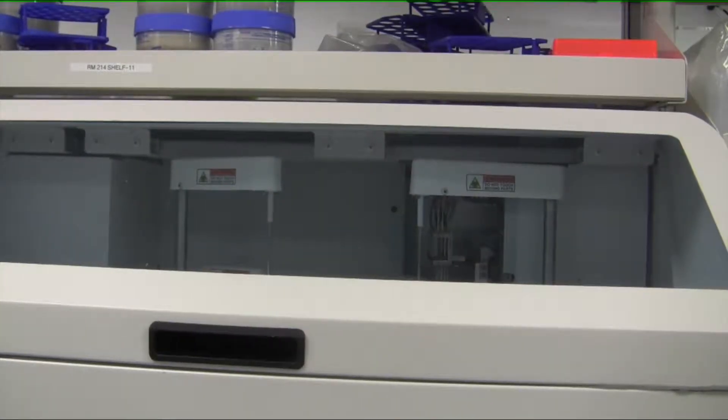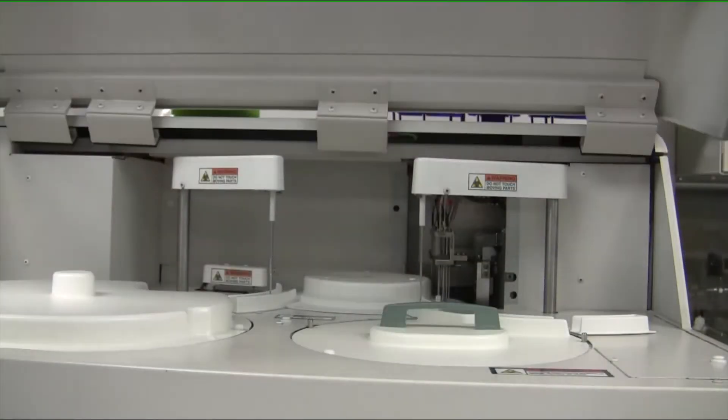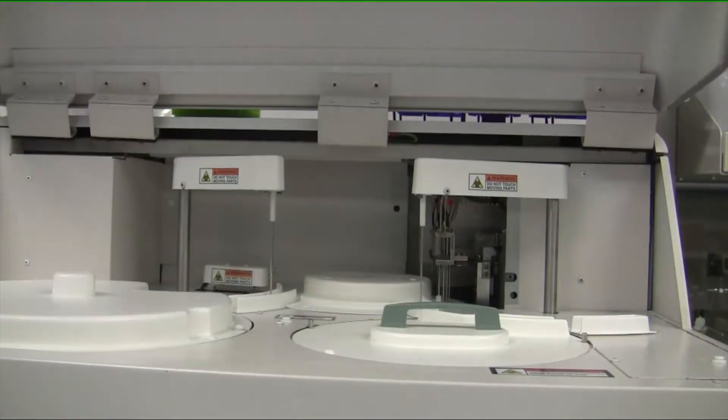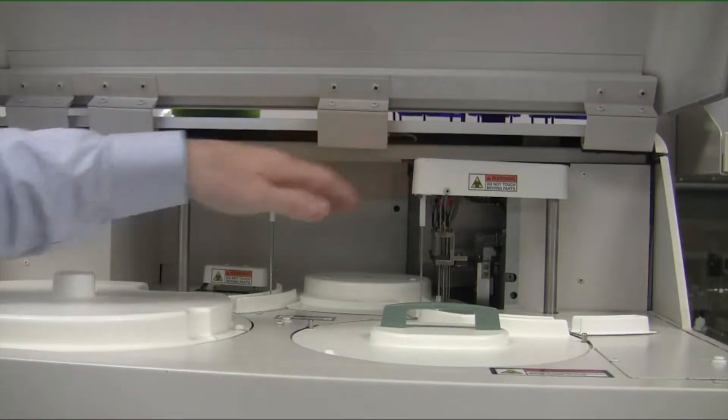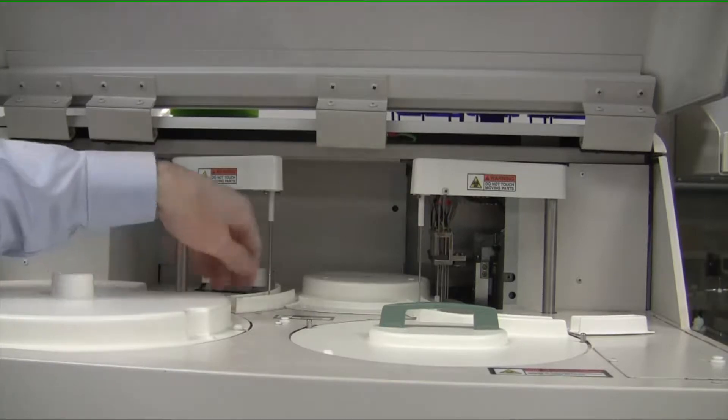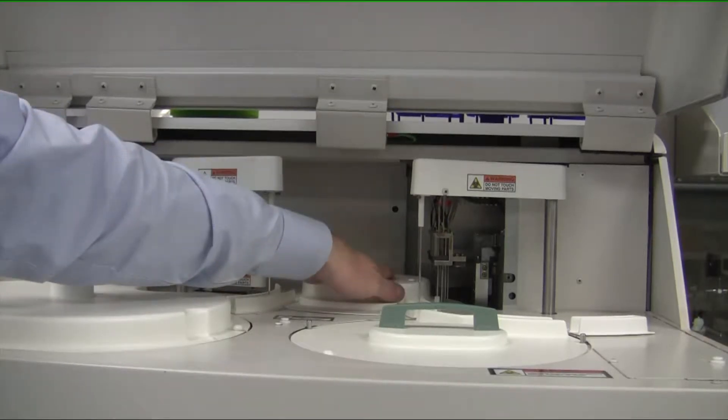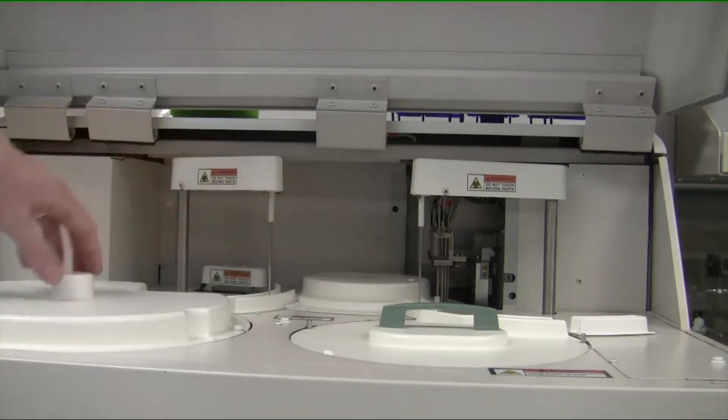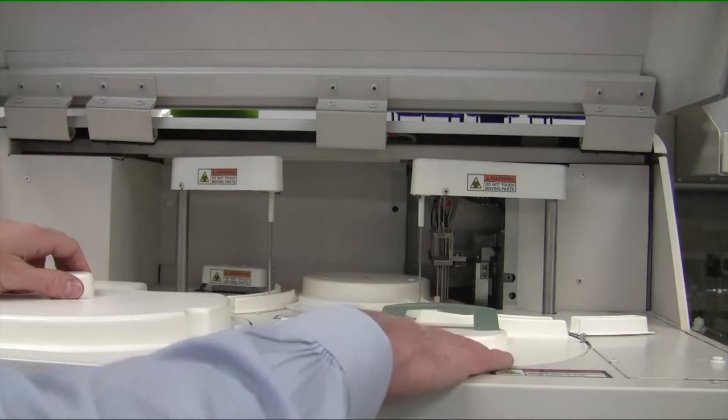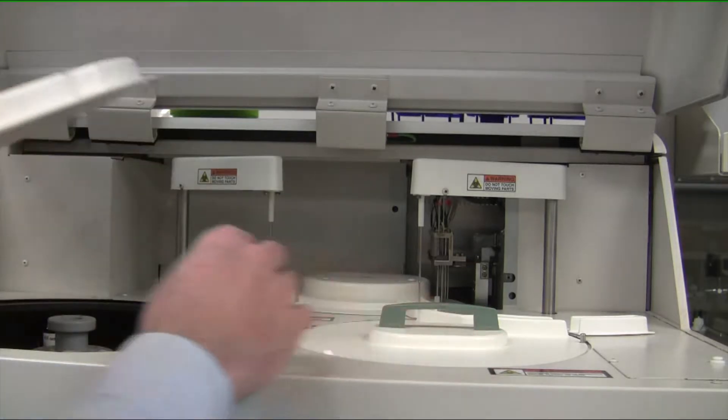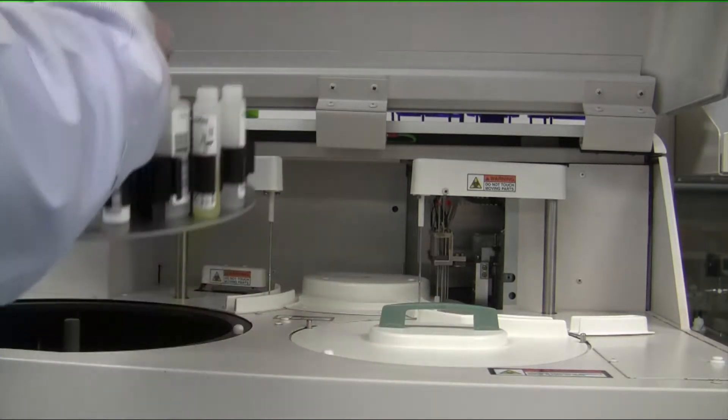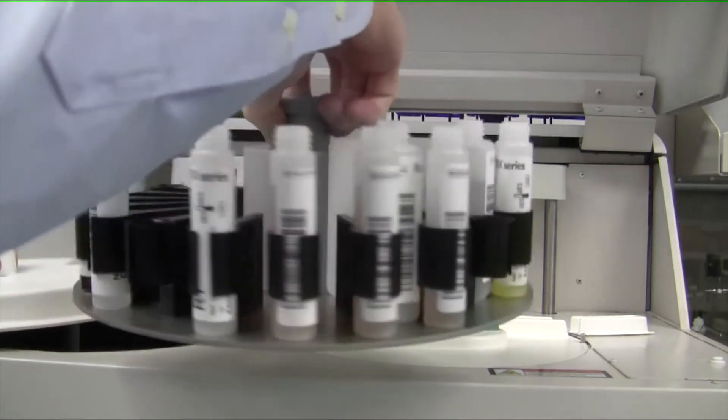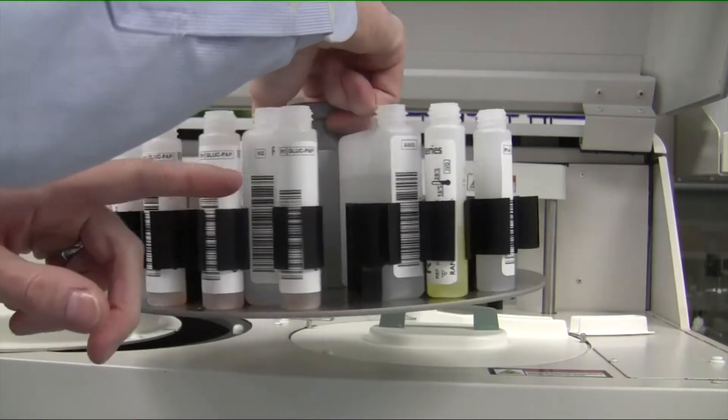This is a brief overview of the Randox hardware. If we open up the lid of the instrument, you're going to see that there are two pipetting arms and one mixer. Underneath here is where all the cuvettes are stored. We have two chambers here. One is for the reagents, so each bottle itself would be for a specific reagent. They are barcoded.